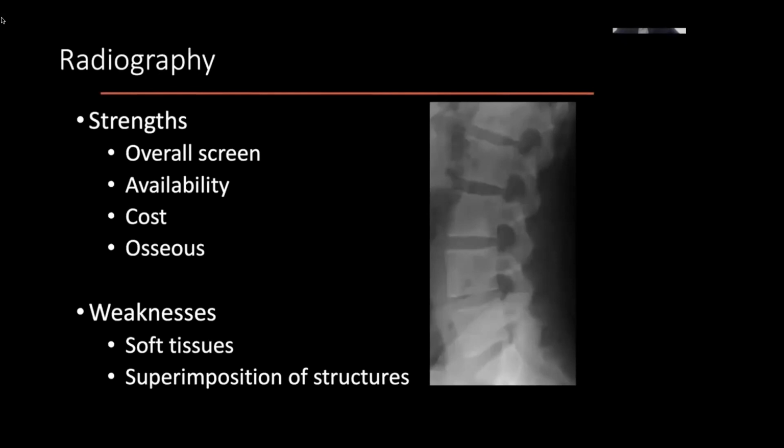In addition, particularly using whole spine radiography, there's several biomechanical features that can be assessed looking at various angles and orientations, which obviously is an entire discussion in and of itself. But as spinal surgeons, you'll learn all about that in residency, the various angles and contours that you may need to consider before performing particularly deformity surgery. And that predominantly relies on plain film radiography or some variant of plain film radiography.